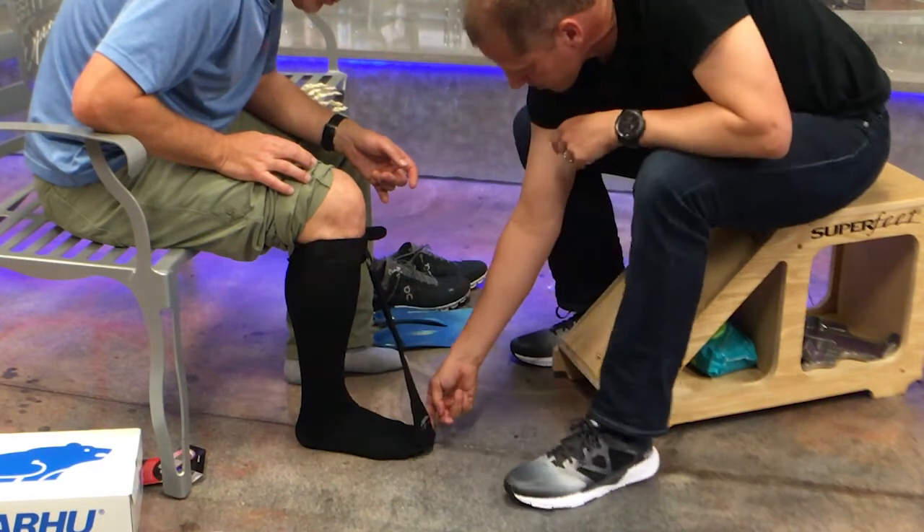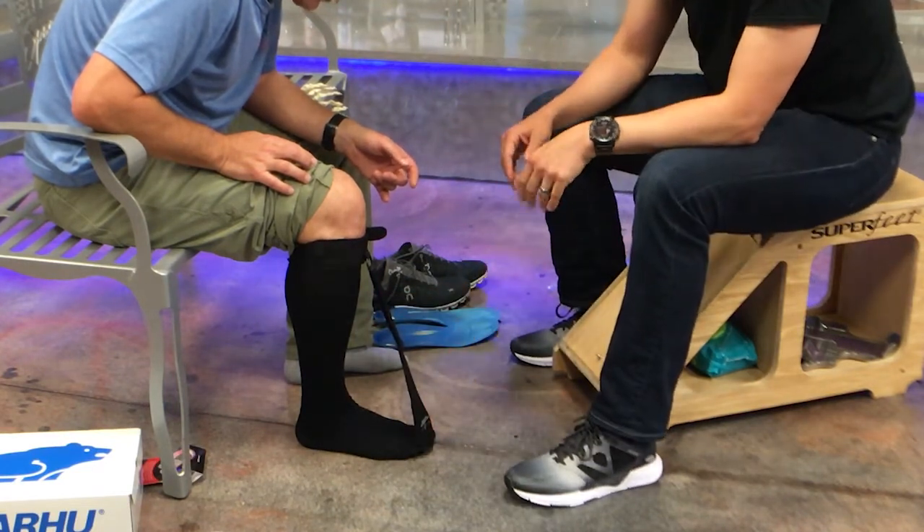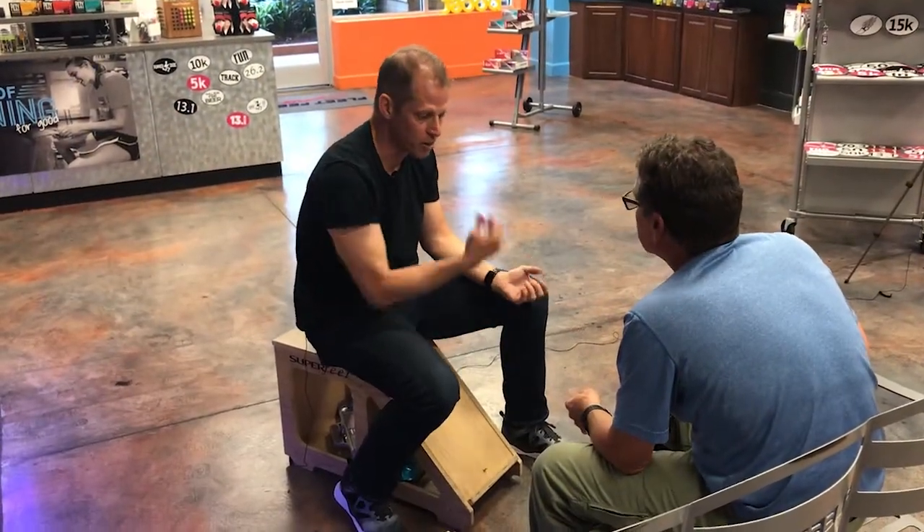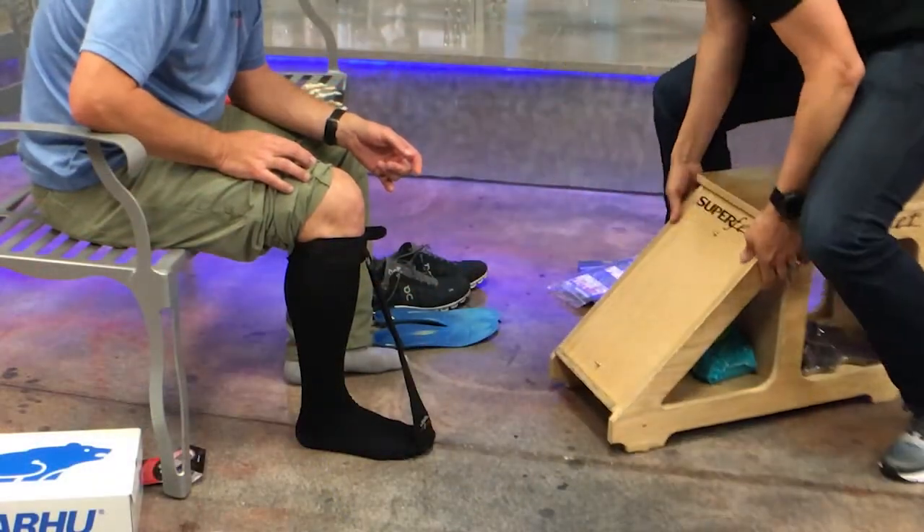When I let go, you really shouldn't feel any stretch or anything. Do you feel anything right now? What happens is when you're off of your feet, when you're non-weight bearing and you put your foot up, the body's going to reposition. So I'm going to have you go ahead and put your foot up on this stool here.